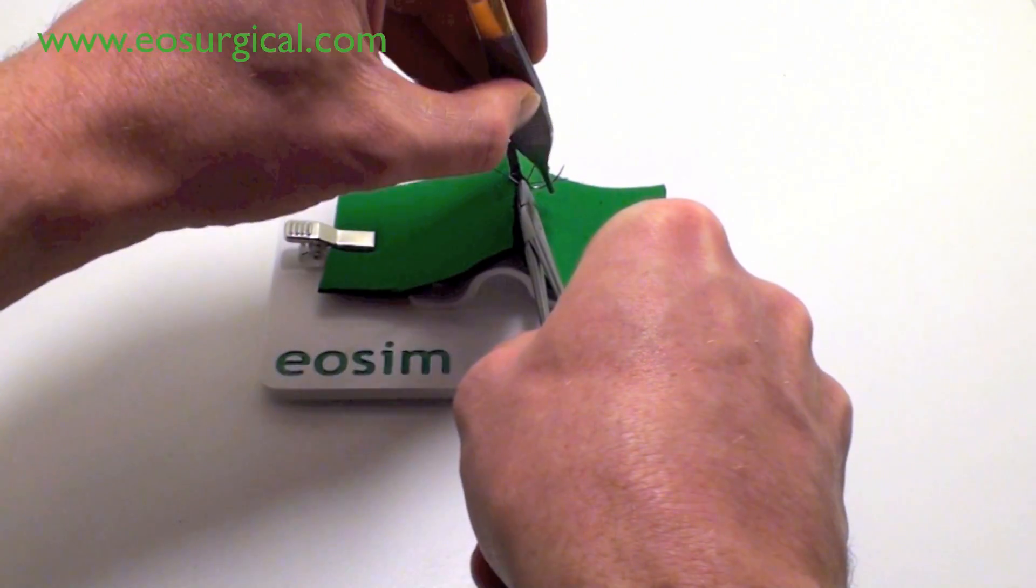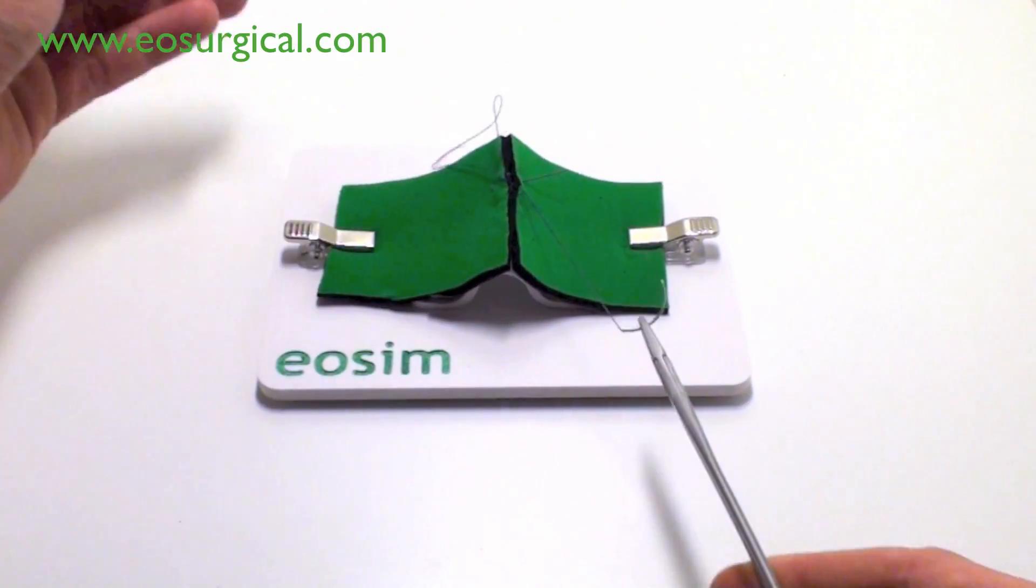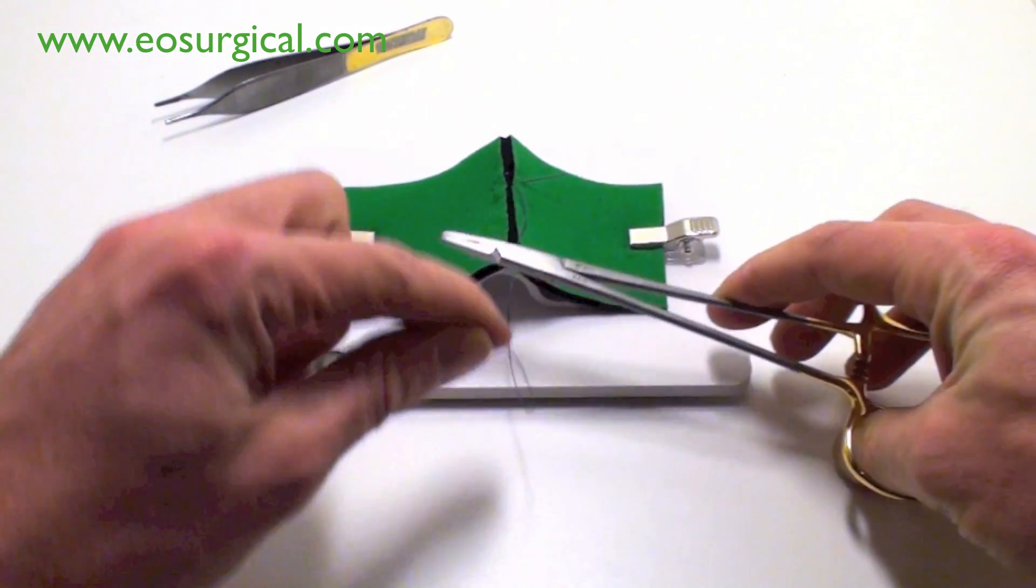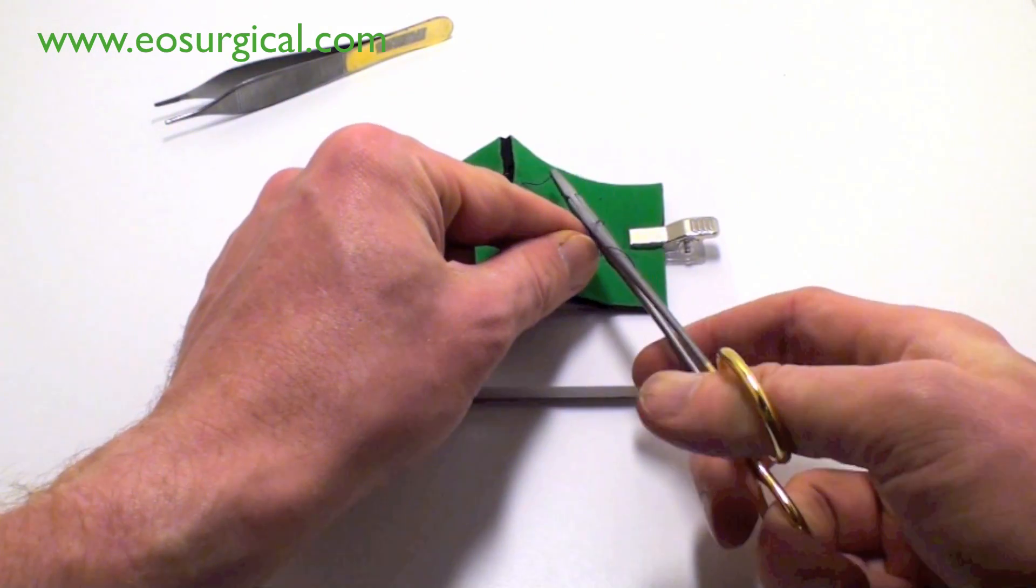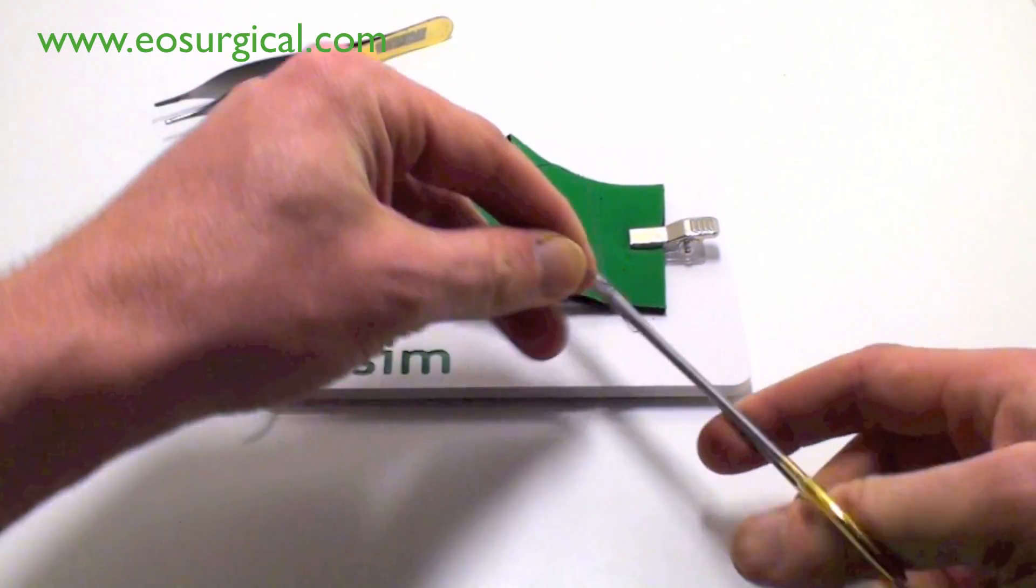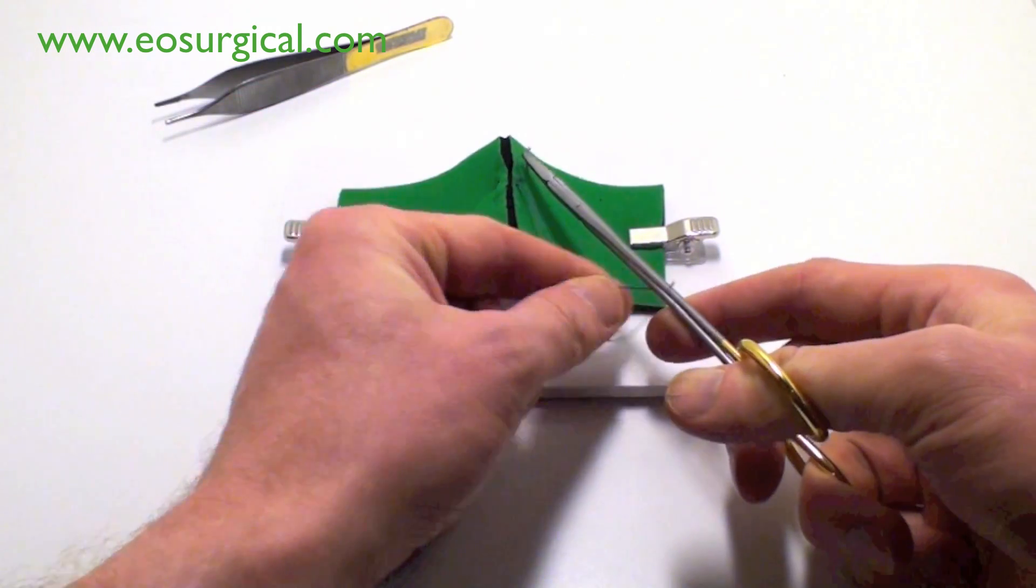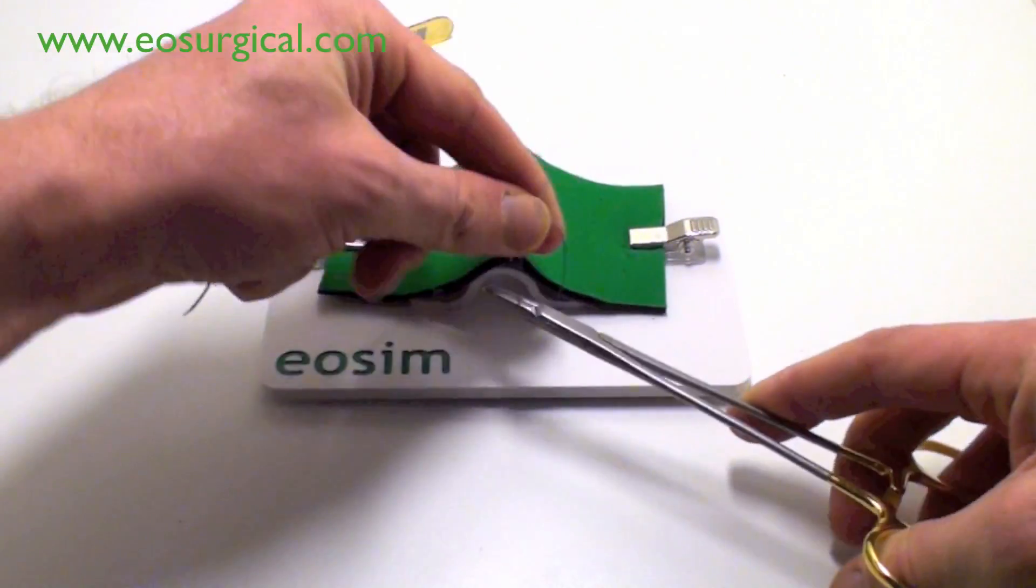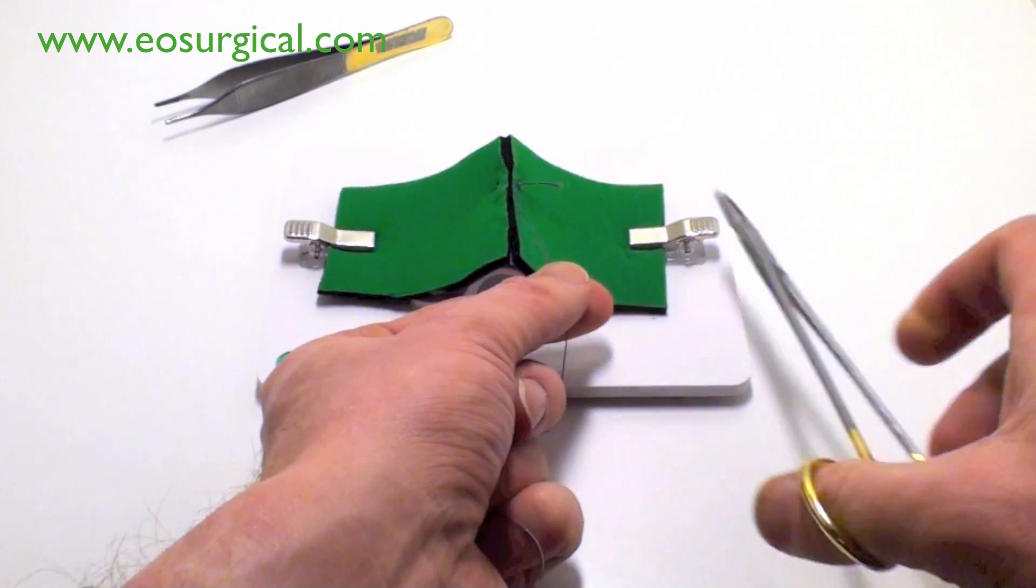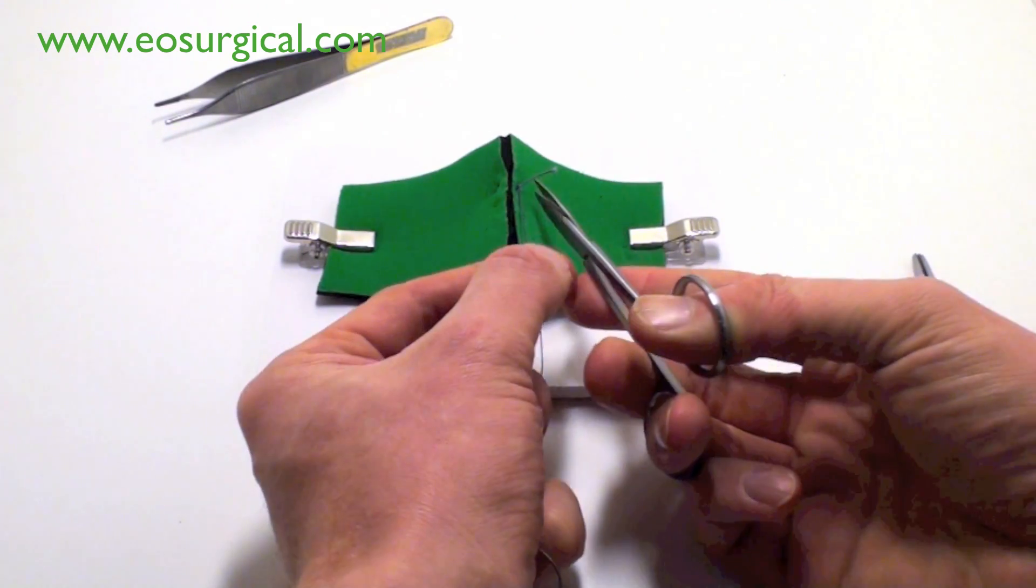Note how I've tried to keep the suture from being entangled while I was placing it in an ergonomic position. And again, at this point, you can tie your surgical knot. Note that the hands are crossing over so that the knots lie square.